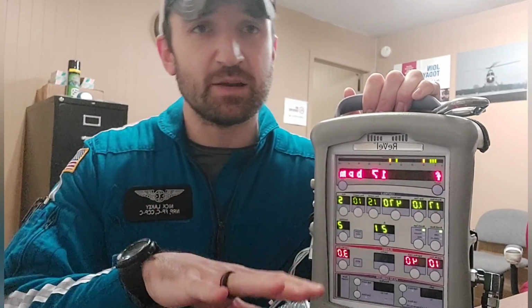And so if all of that checks out, we're going to listen to lung sounds. We're going to make sure that it's nothing on the patient side. We're going to confirm that there's nothing that's obstructing the tube, such as secretions. And then if I don't hear wheezing, I should hear wheezing if it's a bronchospastic type of thing. But if I can't really hear anything, then we'll go over, we'll look at our end tidal. If we see the shark fins, then we'll just go ahead and give the patient a nebulizer. And then, as I mentioned, if you need to suction the ET tube out, we can obviously do that as well. Okay, so that's for a high pressure.